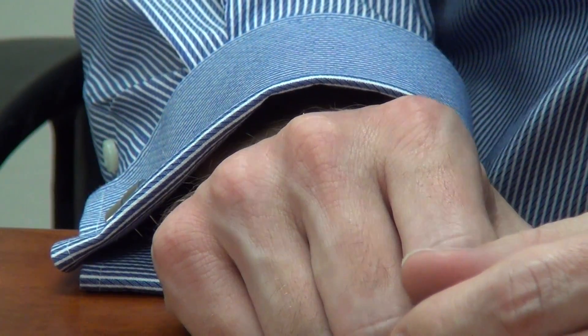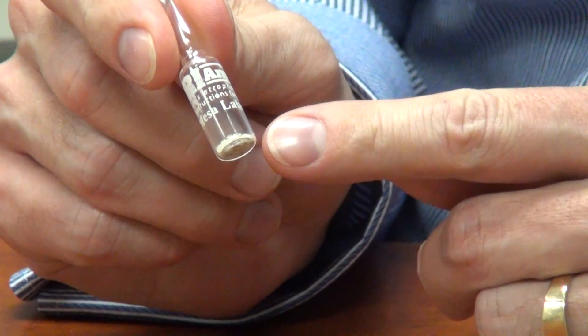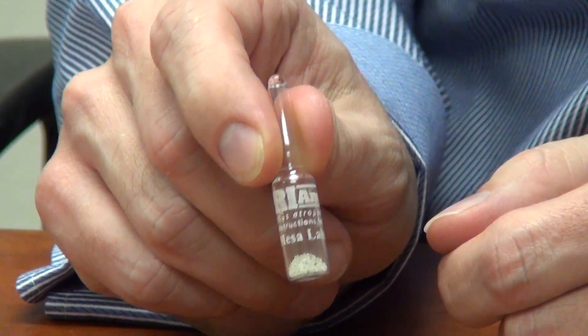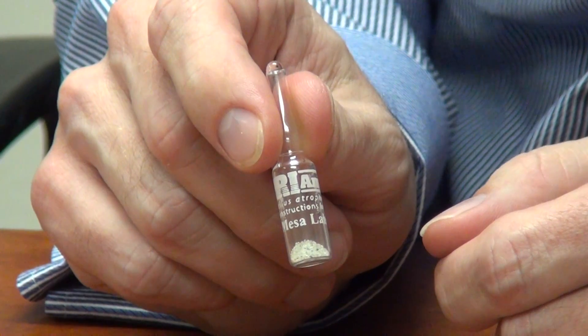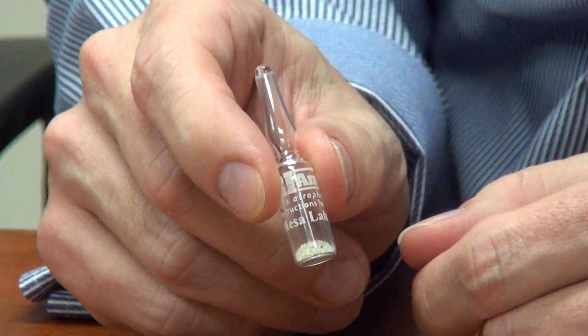To meet the need of these higher temperature exposures, we have the Dry Amp Dry Heat Biological Indicator. Instead of an inoculated paper strip, the spores are inoculated into a sand-based carrier and sealed into a glass ampule. The advantage of the Dry Amp is that in this configuration we can withstand sterilization temperatures in excess of 300 degrees centigrade without the biological indicator degrading.